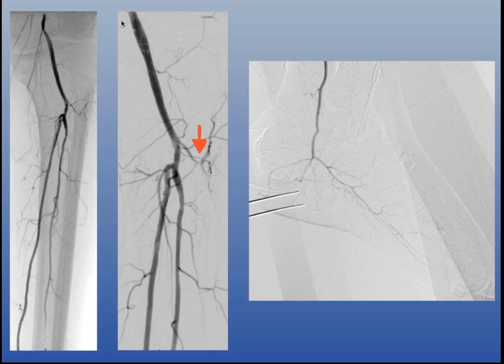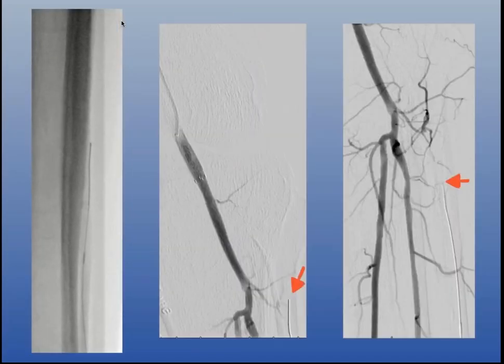And so when I was looking at this, I thought to myself, let me puncture the foot. That's my best chance. I'm going to need dual access again. We don't have much in the foot angiographically, so hopefully we've got a lot of hibernating vessels, which you can look at with ultrasound, and you may see a low pressure pulsating dorsalis pedis or AT, then you know it's hibernating for sure. And so same thing, I punctured from below.